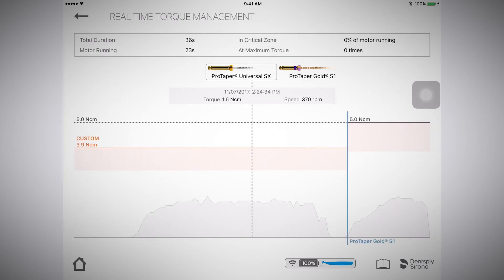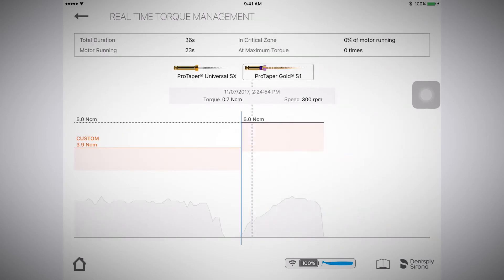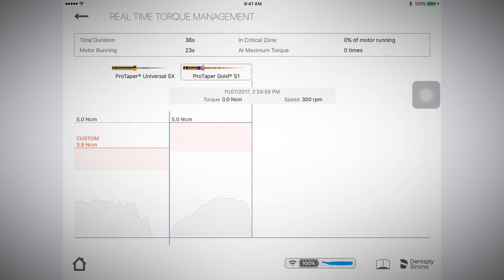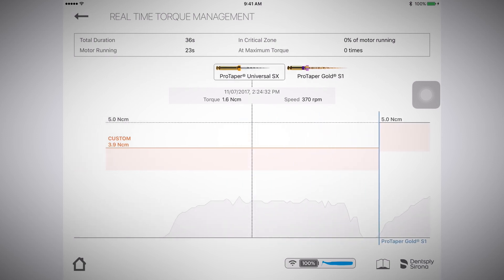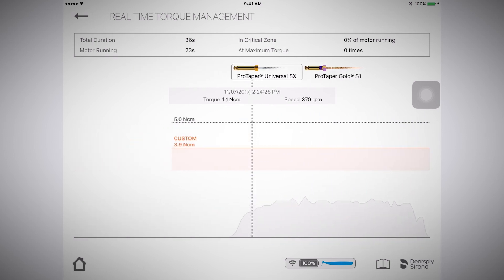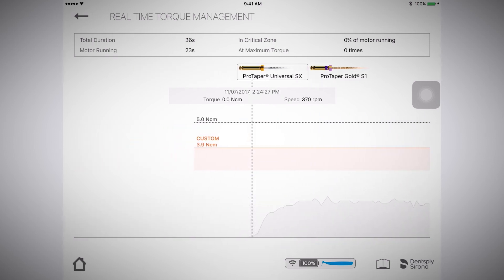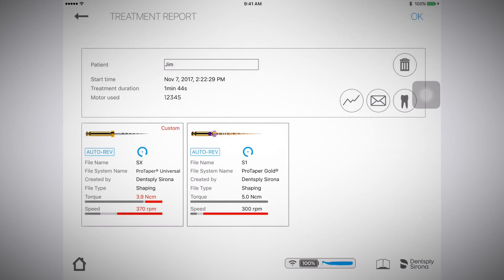The graph icon shows the different torque levels. You can see the different values that were recorded based on the different files that were used during the procedure.